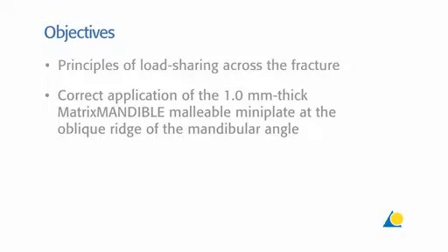The learning objectives of this presentation are the principles of load sharing across the fracture and the correct application of the 1.0 mm thick matrix mandible malleable miniplate at the oblique ridge of the mandibular angle.